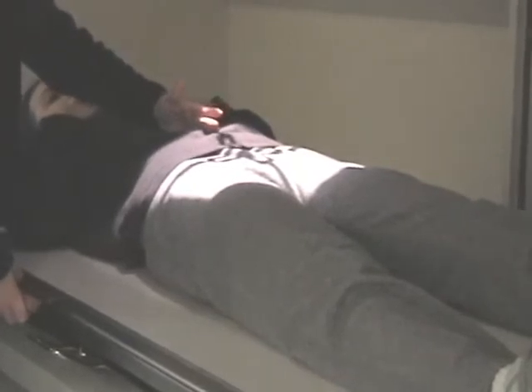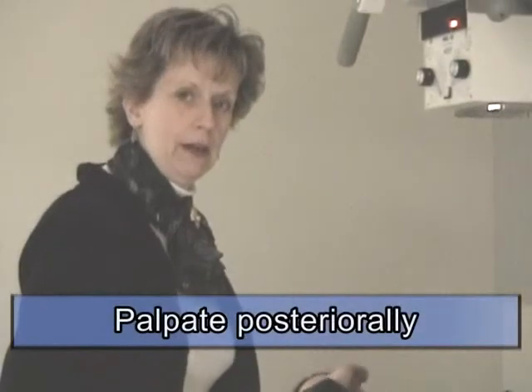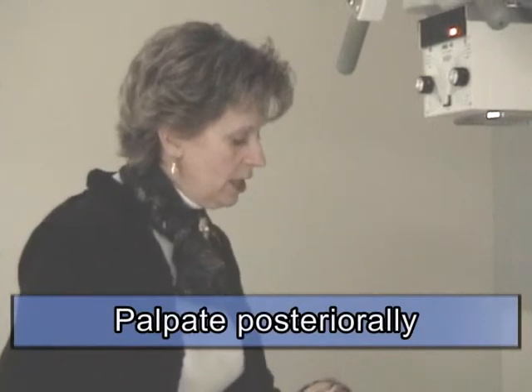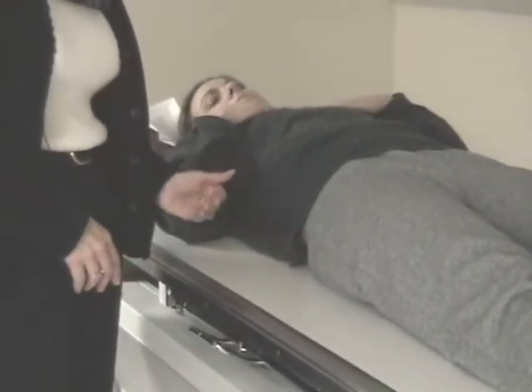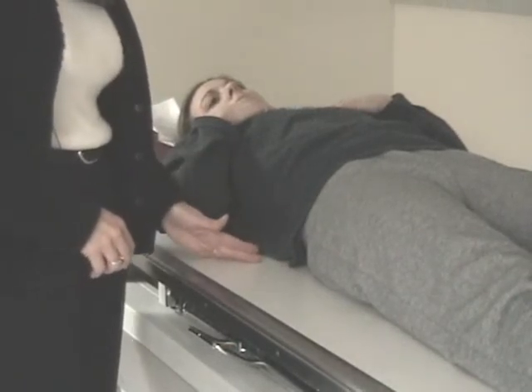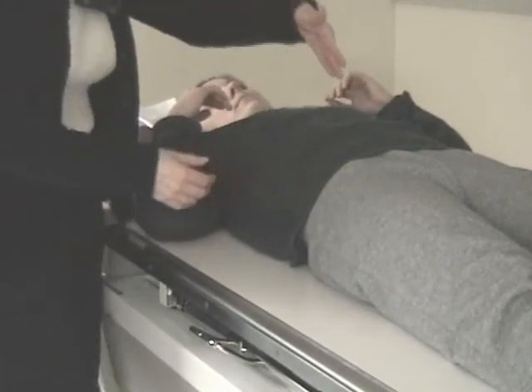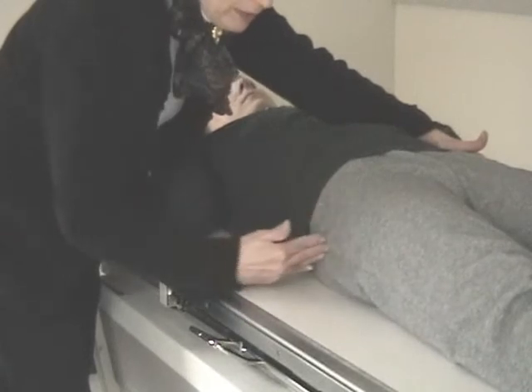Okay? And then what I'd like to do is palpate for the iliac crest. From previous lessons of the abdominal series, I want you to remember some things. I want you to palpate posteriorly. If you palpate anteriorly, you think you're at the top of the crest, but remember that the crest angles higher as it goes posteriorly. So I'm going to feel posteriorly. I'm going to palpate firmly with my fingertips. I'm going to kind of reverse my position here so you can see from a camera angle what I'm going to do.